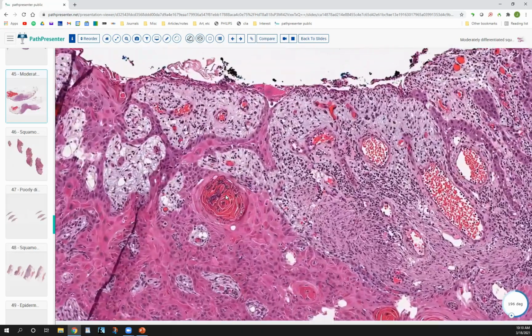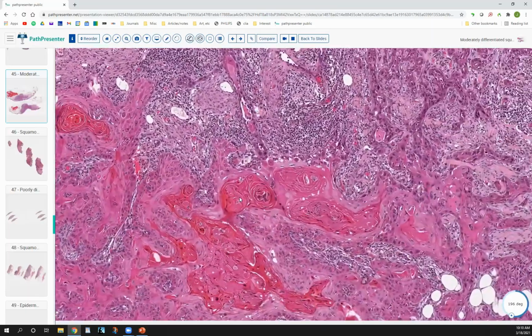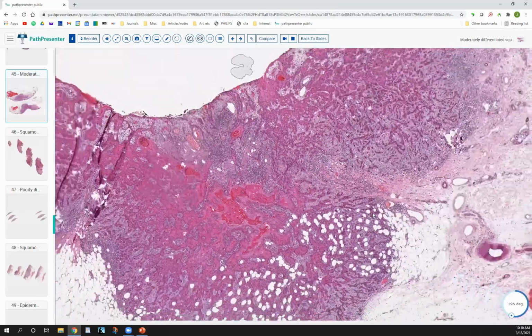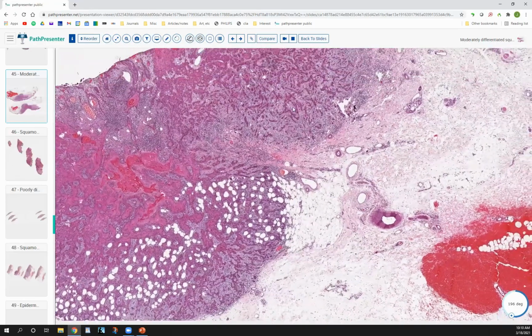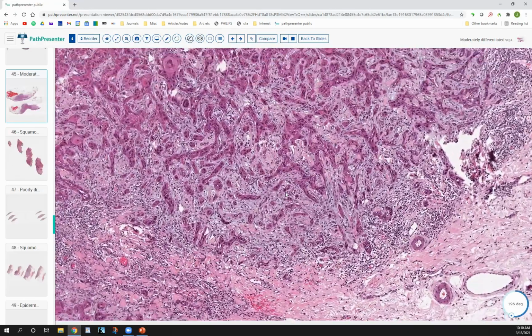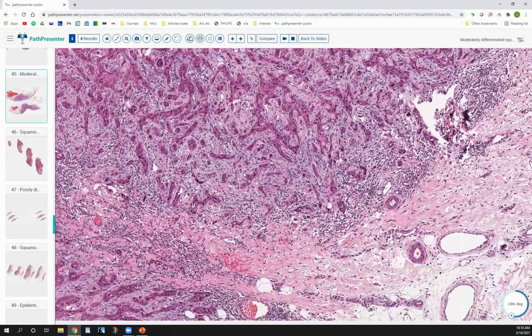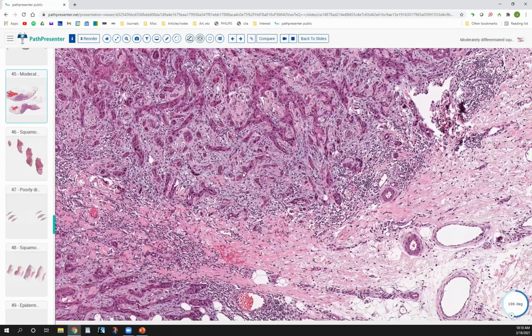Here's another example over here. So if you ever wonder what those are, I think pretty nicely represented here. And again, no problem determining atypia here, this really jagged angulation of these squamous cells. You can imagine how this would quickly become, if left to grow unchecked, very, very ugly and dedifferentiated or poorly differentiated, and be difficult to even recognize as squamous cells.